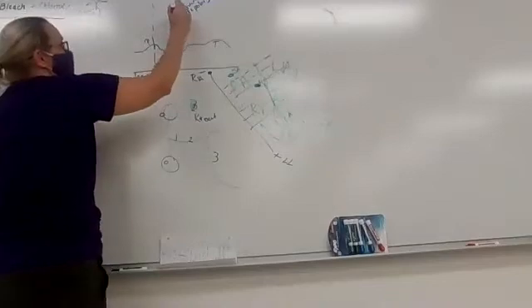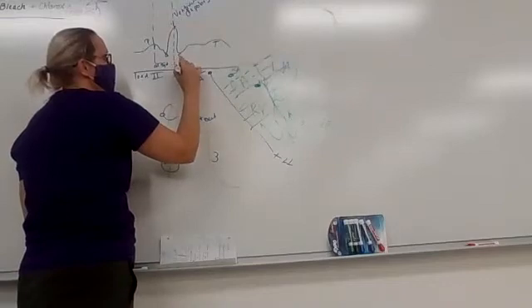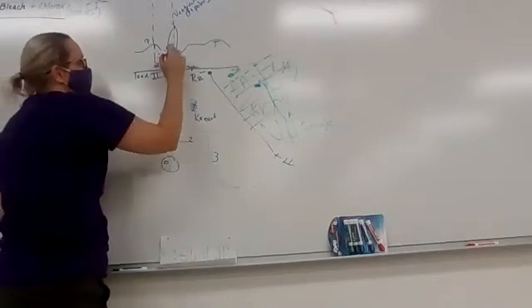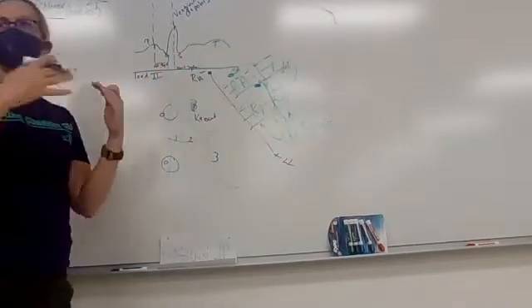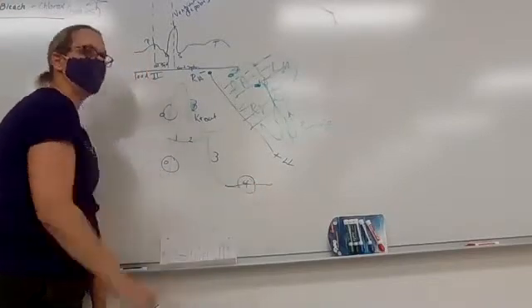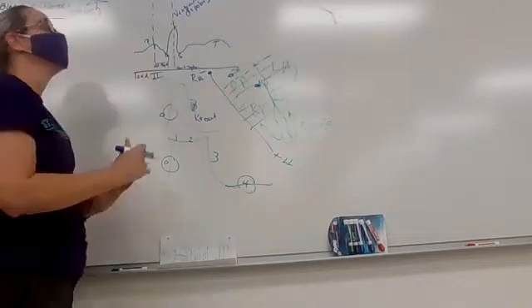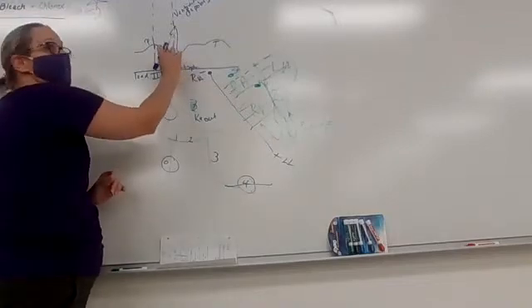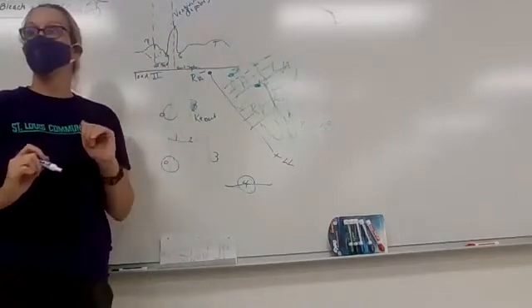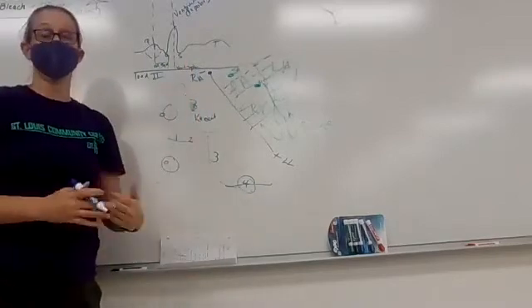Okay? So what we should expect to see around the middle here is when, again, the ventricles go into their systole. Okay? Now, somewhere in here, the atria did fully repolarize and reset. And so the majority of their cells, again, are in stage 4, nothing's happening. At the same time that the ventricle depolarizes, the atria repolarizes. Right. So do you see the atria truly have a matching upside down wave to the P wave? No, because it's masked by the ventricles depolarizing.